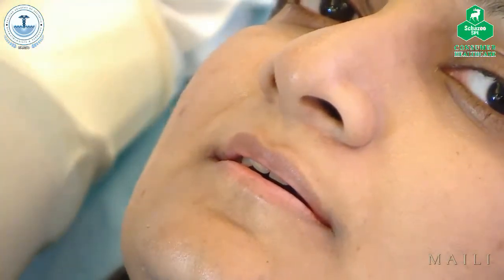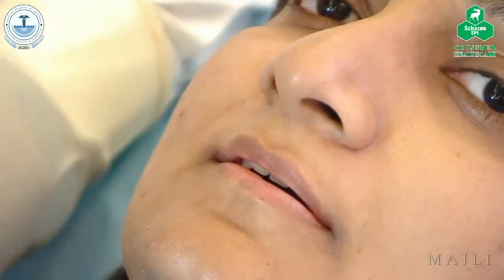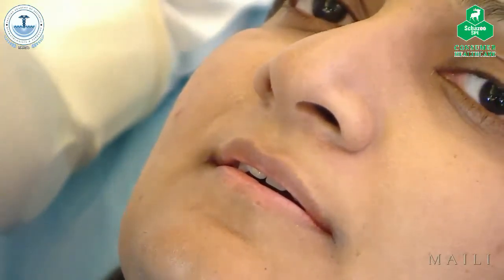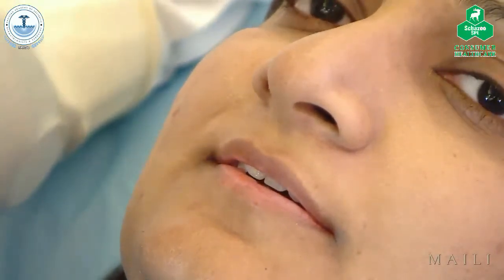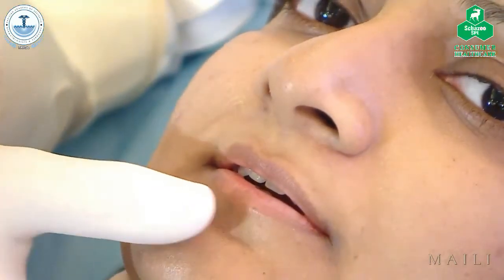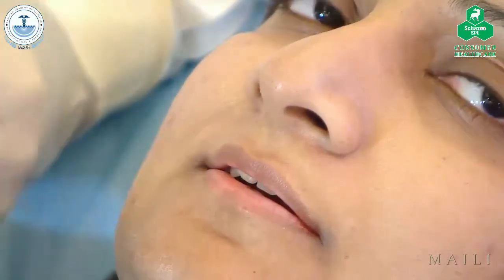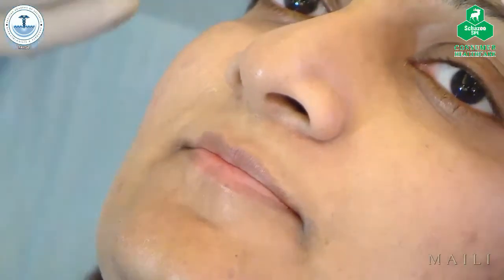You can do like Rami showed, going more vertical. And you can do something I really like, a very old technique: going to the back of the lip to bring it out. When I have small, thin lips and cannot have much room to get a lot of volume, I like to start with that, and then I just balance it. But the lower lip needs quite a good work, because the mouth is wide, with nice support on the sides, and I also need to bring it outwards to balance with the upper lip. So let's do it. Let's see if I can get it right without making anything bleed.